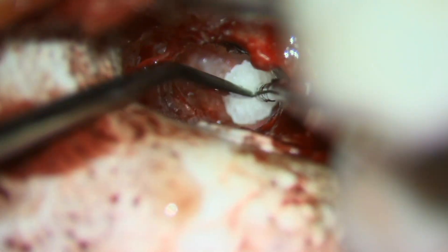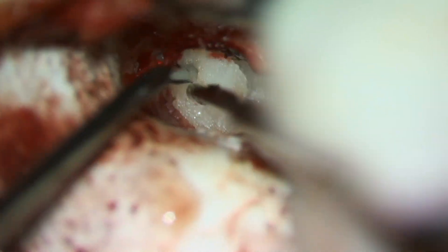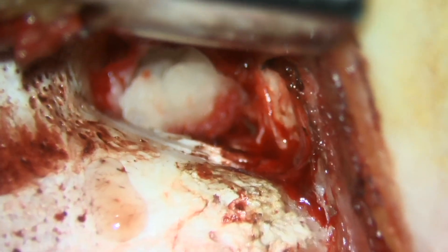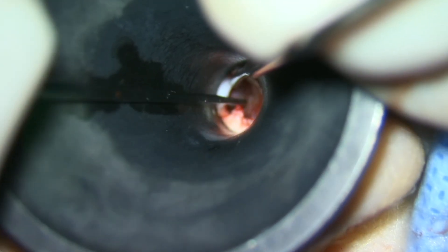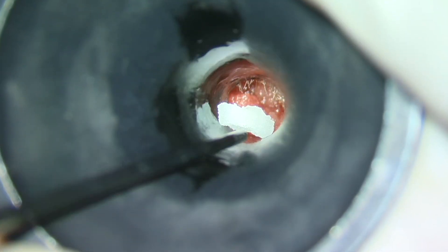For reconstruction, we placed a temporalis fascia graft, which we harvested when doing the posterior approach, and placed it as a medial or underlay graft behind the residual TM and malleus, then laid the tympanomeatal flap back down. We then packed loosely with gel foam and flipped the ear back. We had to make sure that our vascular strip was totally unfurled, because no one wants an iatrogenic canal cholesteatoma when removing a congenital cholesteatoma, and then packed with more gel foam.